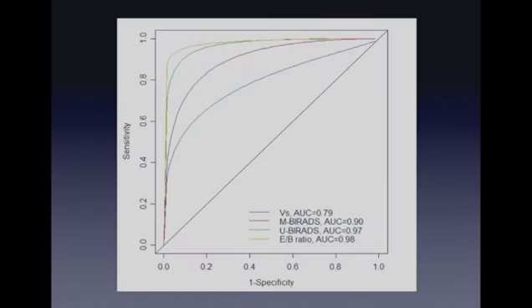These are the ROC curves, and let's go through these. The blue line is the area under the curve, or the ROC curve, when we look at the velocity itself without the use of the quality map. The purple line was mammo-BIRADS, assuming that BIRADS 3 was negative. The green line is our conventional ultrasound, and the yellow line is the ROC curve for our strain ultrasound. And you can see that, at least in our hands, the strain elastography provided the best information.